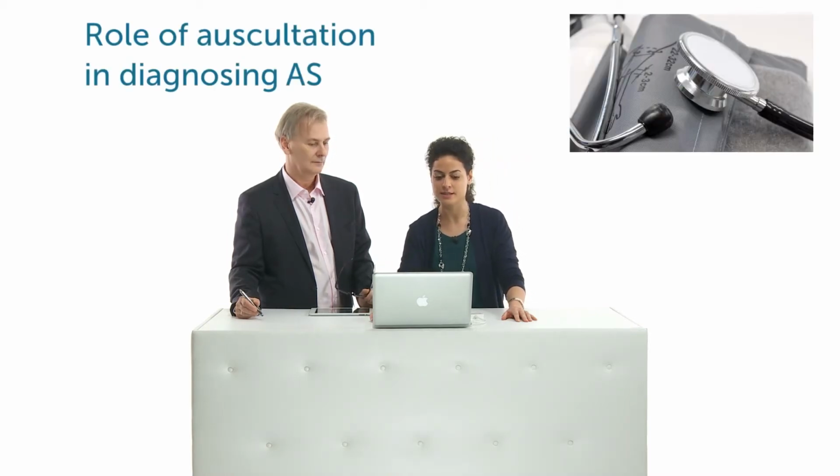Anna, do you hear this? This is aortic stenosis. This is a wonderful auscultation signal. Don't you think we can diagnose it with auscultation? Yeah, Thomas, this is what a young colleague of ours actually told me once, that he could be faster with his stethoscope in diagnosing aortic stenosis than us with echo. The problem is that when you want to use your stethoscope, first you need silence around you.